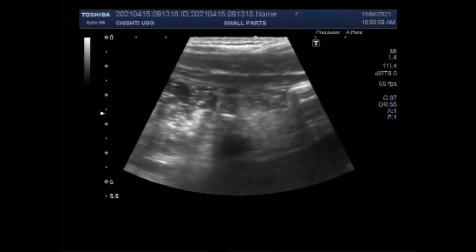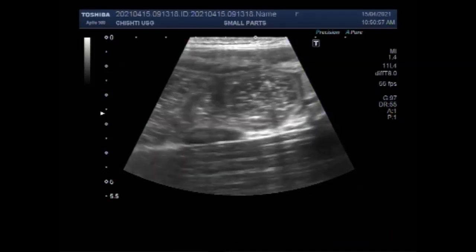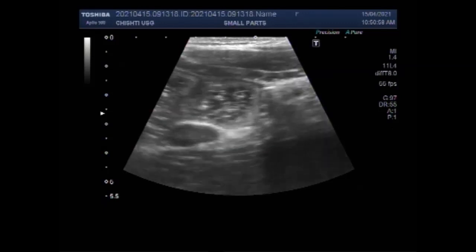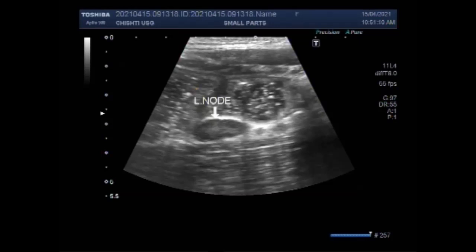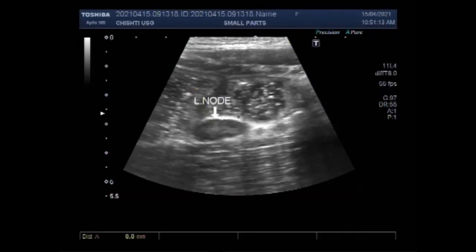You can see the ascending colon, and an enlarged lymph node is seen in the adjacent area of the cecum. This lymph node measures about 19 millimeters by 7.5 millimeters.